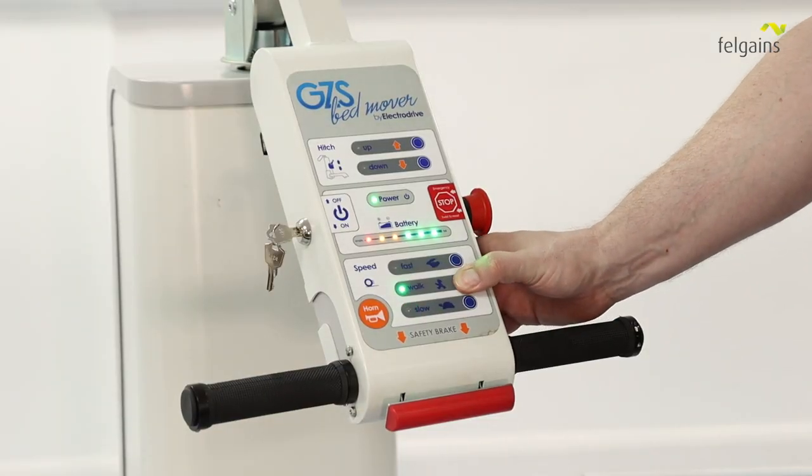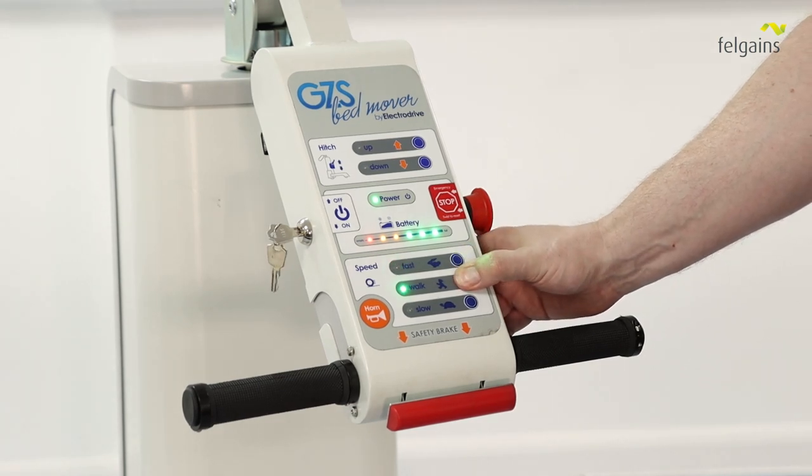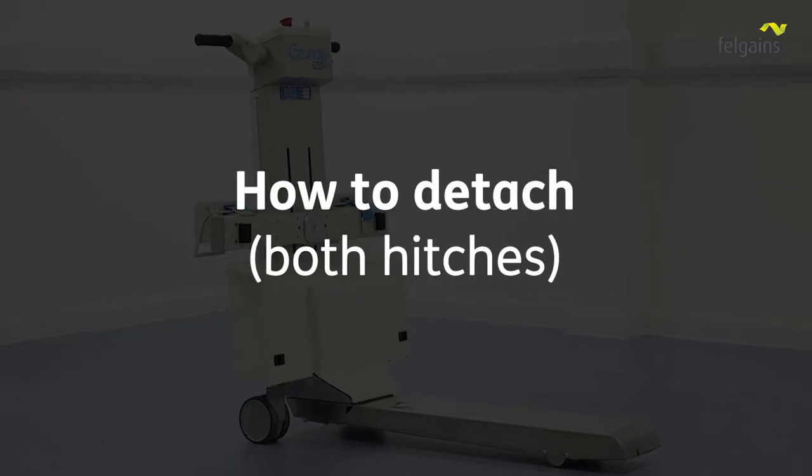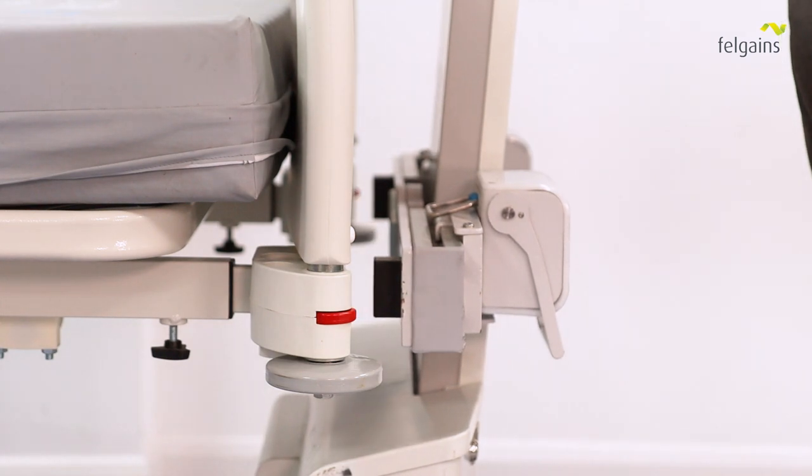The Felgainz bed and stretcher mover has three speed settings to suit the task and environments that you are using it in. Once you have reached your destination, simply carry out the reverse of the process you used to attach the bed mover.